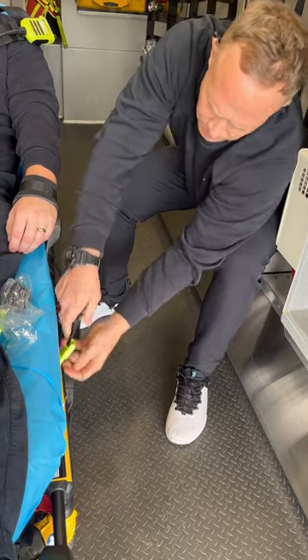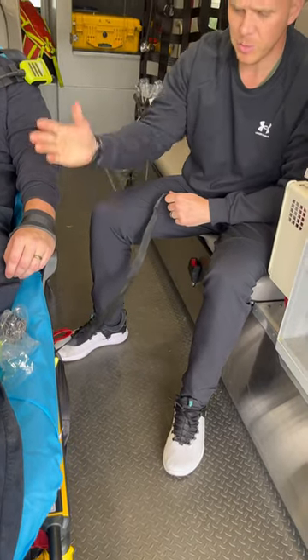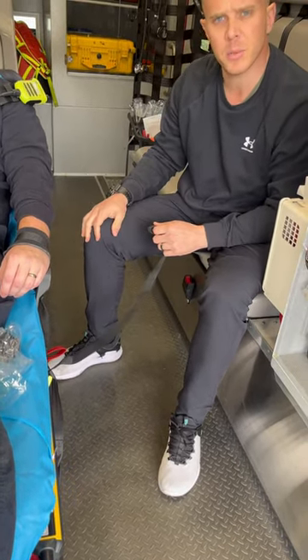Flip it into the clip anchor and cinch it up. It's that easy, and when you're done with it, you can just toss it. And that's the disposable cuff.